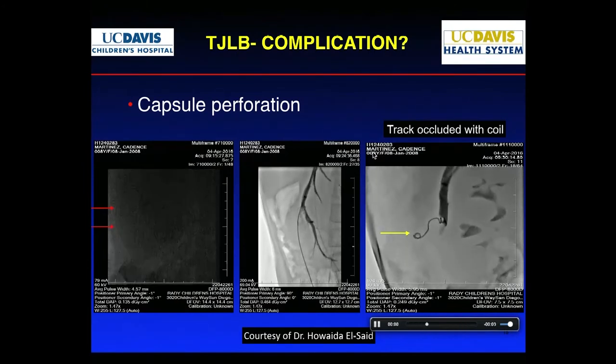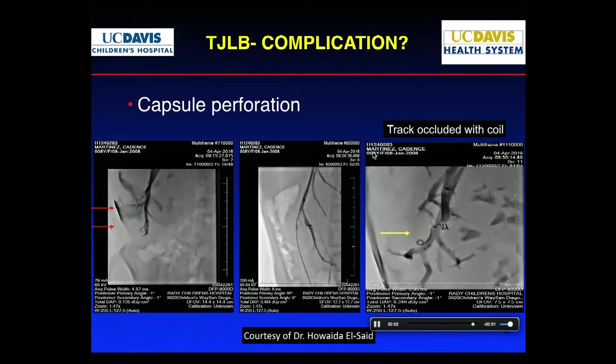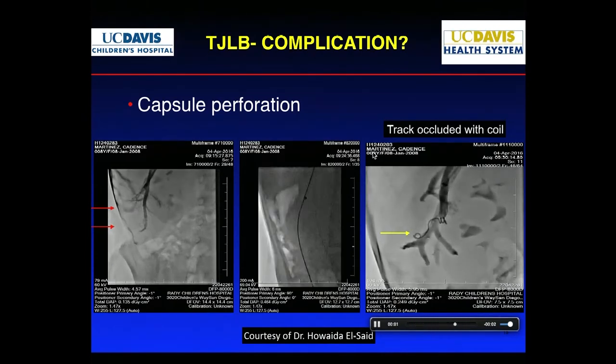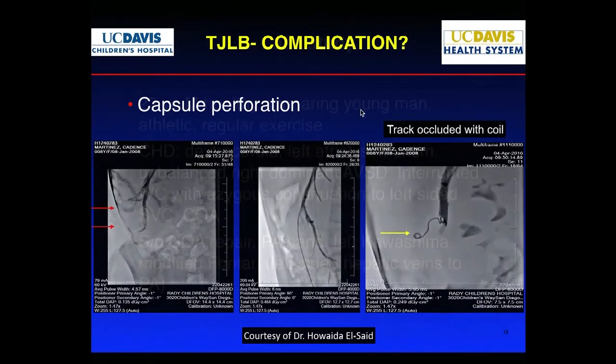When I first started, once I put my sheath in the system, I measured out what the 2 centimeters would be so that I know if my position is enough to get to the liver capsule. I don't do that anymore, but when you first start, just make those measurements for yourself.